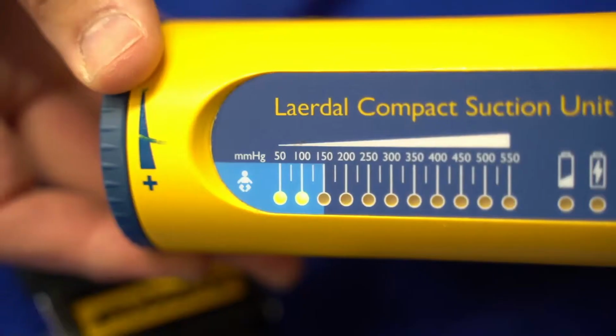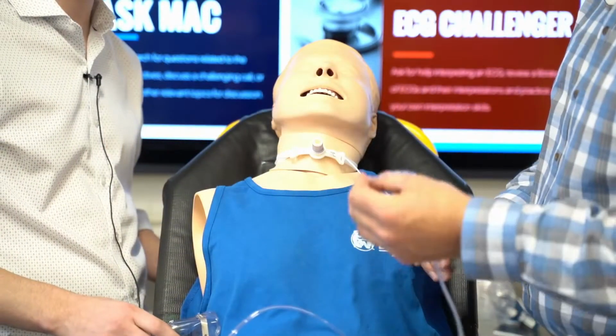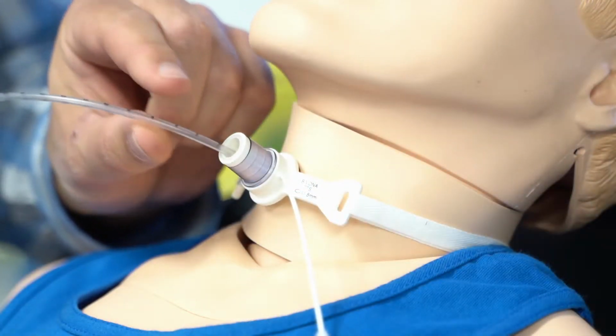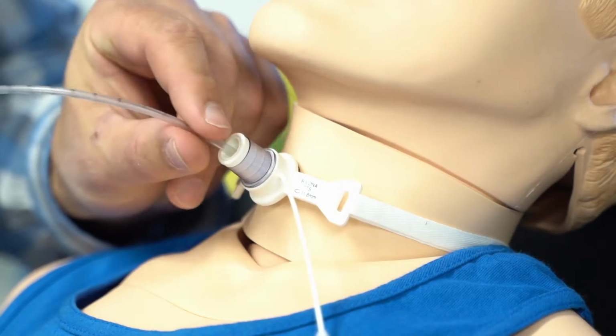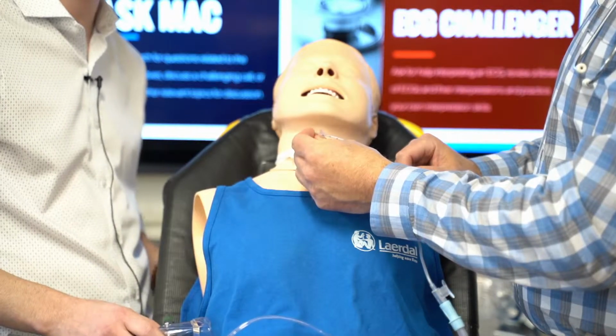He's going to use his predefined suction settings. We're going to start at 100 for this patient, and then he's going to insert it. As he's inserting it, the patient may cough or he may feel resistance. He's going to back up 1 centimeter after that's done, and then he's going to suction all the way out. He has a number of attempts to try to clear this airway.